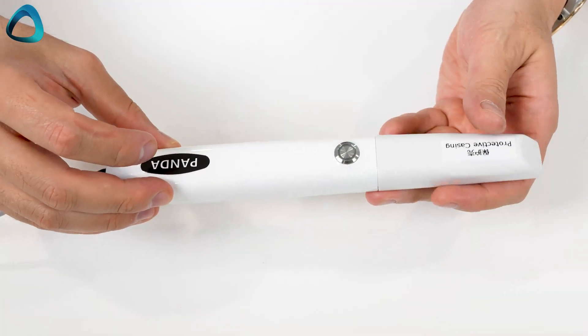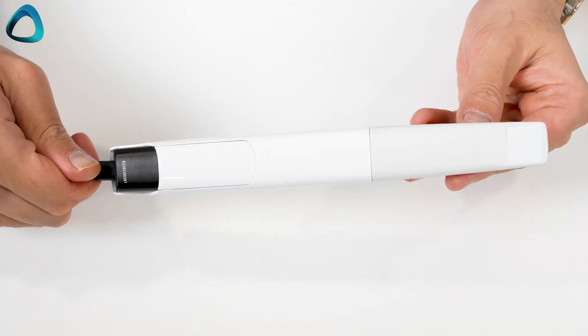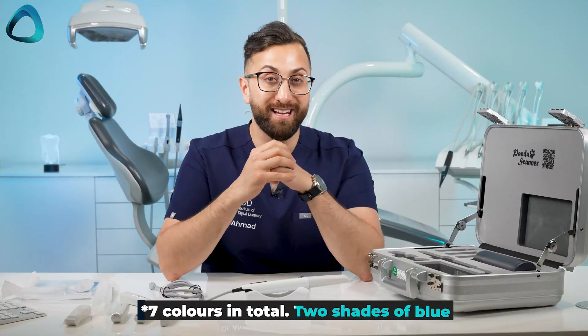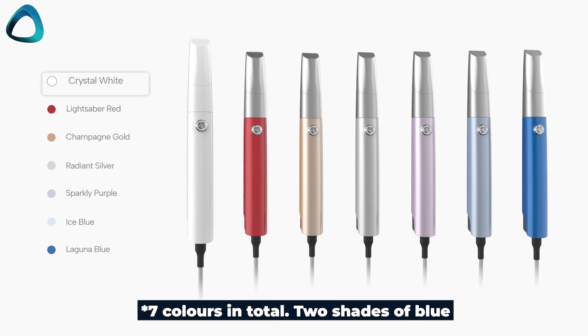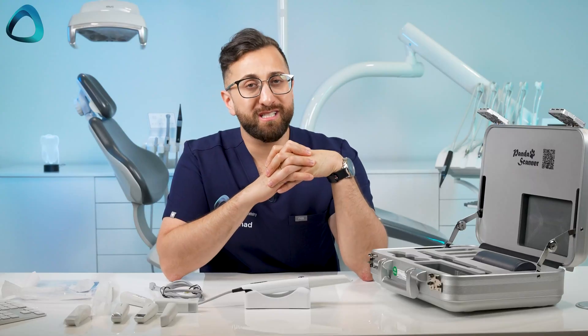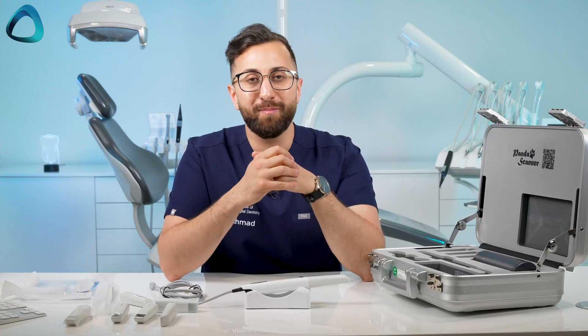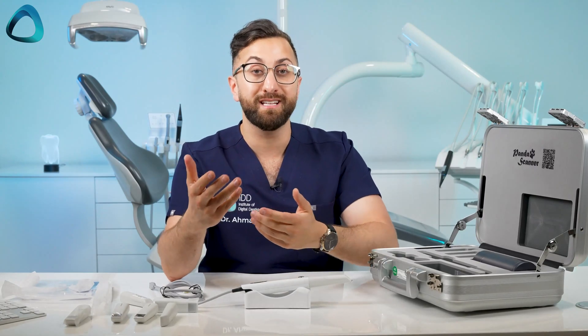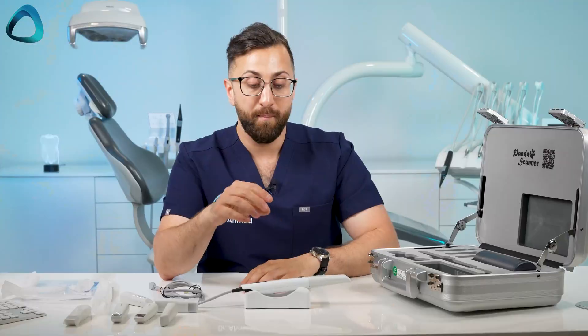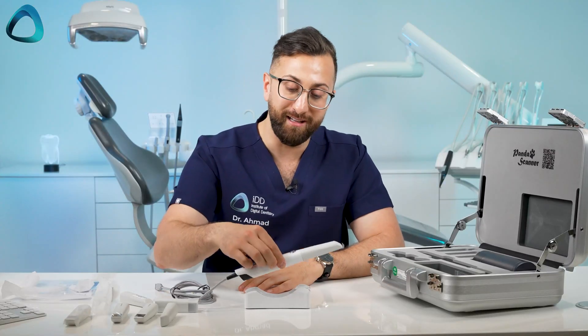One interesting thing to note about the Panda scanner is that this one is white, but the company has done something really interesting in that they actually offer six different colors: red, white, yellow, silver, purple, and blue. We haven't really seen that in the scanner market, and I think it's quite a nice touch to make it more personalized — to fit the aesthetic of your practice. Maybe you have a red dental chair or something, but you can get these in different colors.